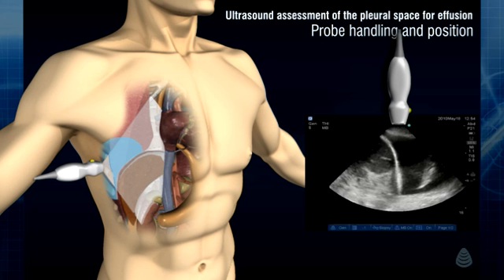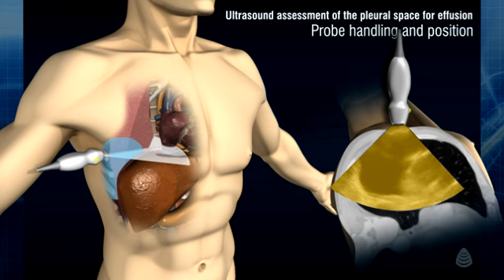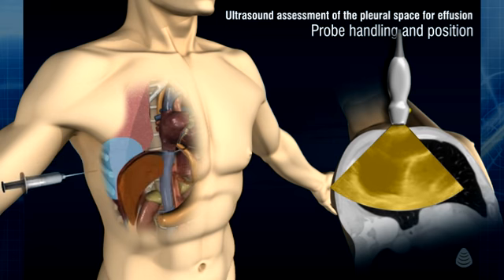If the decision to tap or drain the effusion is taken, this view will allow for the determination of a safe area for needle insertion and trajectory, away from the main organs. By not providing a view of the surrounding structure in the scanning plane, the transverse view increases the risks of having an inadequate site and trajectory of needle insertion, thus increasing the risk of inducing organ injury that could potentially be catastrophic.